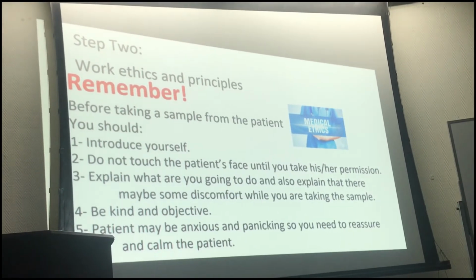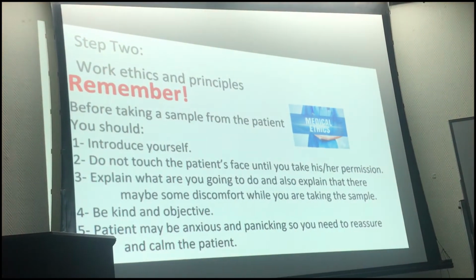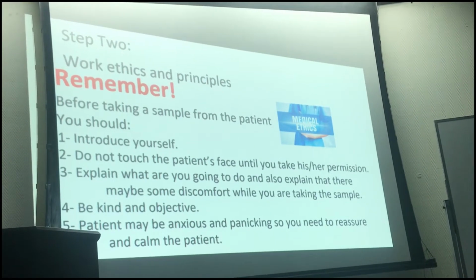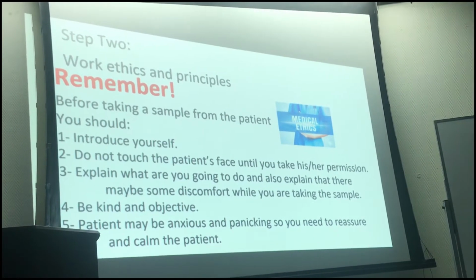Before taking a sample from the patient, you should introduce yourself. Do not touch the patient's face until you take his or her permission. Explain what you are going to do, and also explain that there may be some discomfort while you are taking the sample. Be kind and objective.